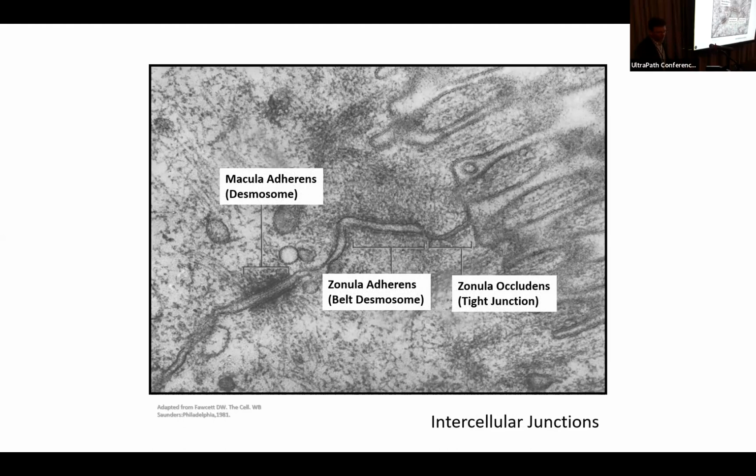These are gorgeous pictures that he's showing you. And I want to say that those tight junctions, I use them a lot in my diagnostic work for tumors, because people do use it for tumors. Not as common, but I do. And those tight junctions are very, very prominent in the liver, because you don't want that bile to be spilled, or in the GI tract. So the colon has these beautiful tight junctions. He's showing you the most gorgeous photos. In tumors, they're not as gorgeous because they're distorted. So keep that in mind, because these are amazing pictures.